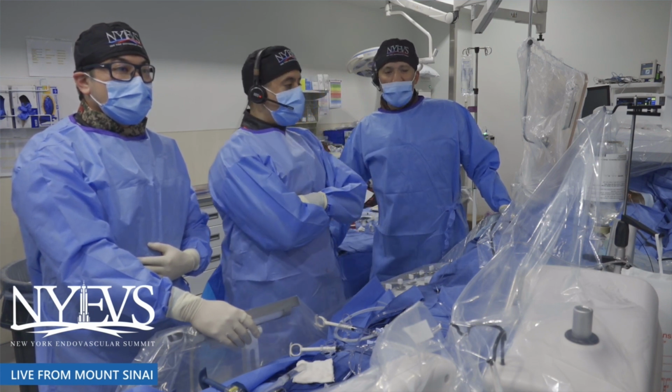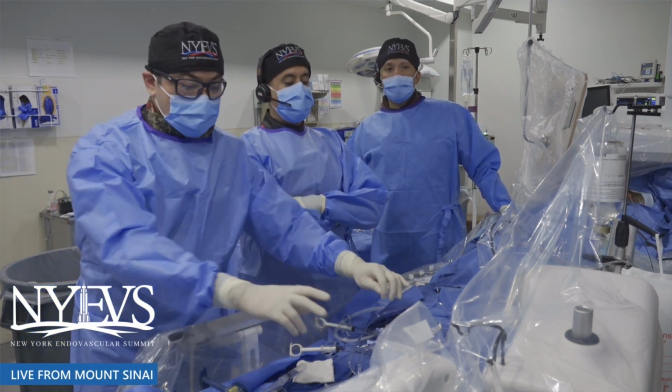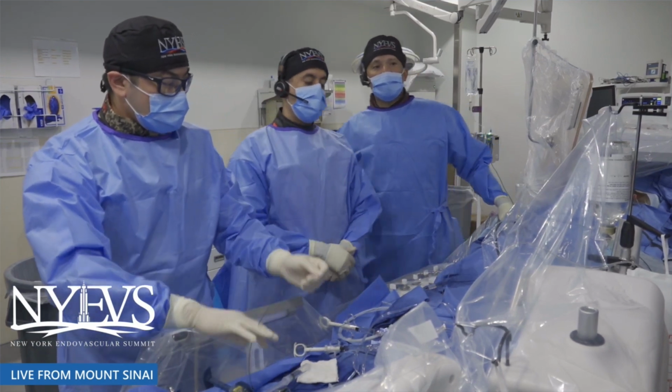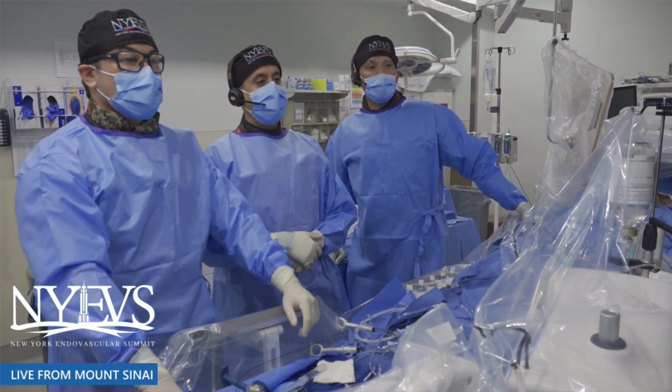Yeah, and I think where the calcium is and how extensive it is matters. Is it really part of the lesion that's obstructing the lumen, and you need something like IVL to push it out of the way to get full expansion of your stent? Or is it medial? There's also thick calcium versus more spotty.